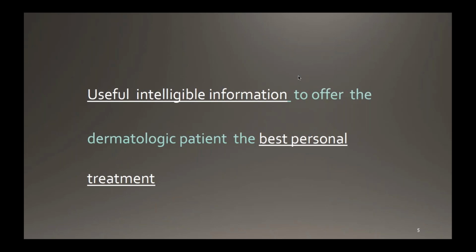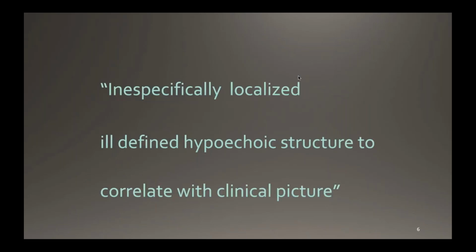Dermatologists require useful, intelligible information that they can understand, to offer more value to their patients for a best personal treatment. These three parts, useful, intelligible information for best personal treatment, are important, because the dermatologist must know what you are saying.